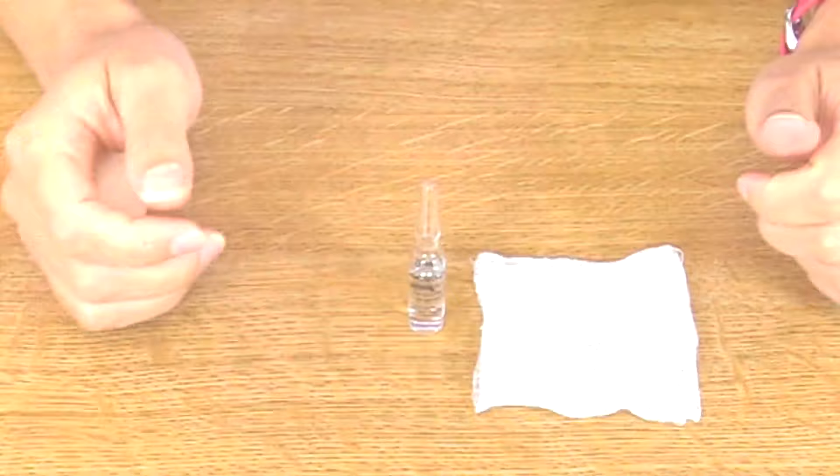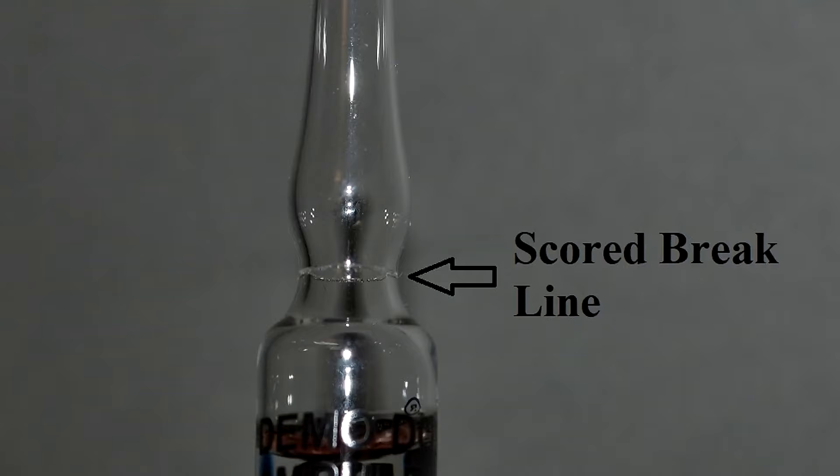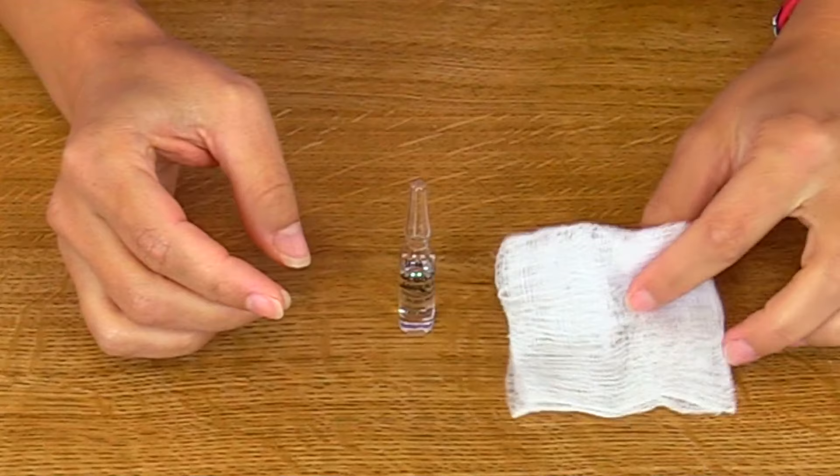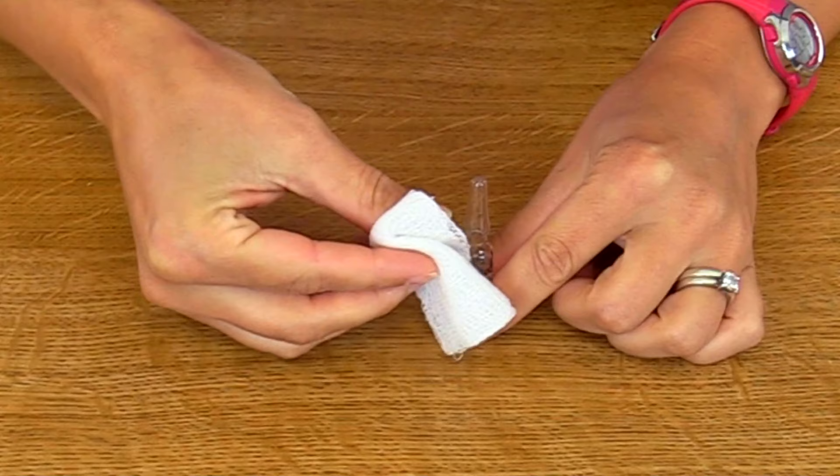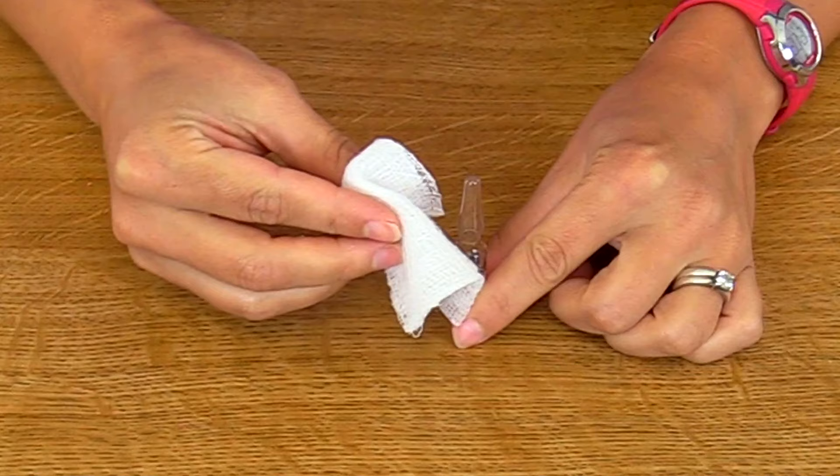Now we're ready to break open the ampule. Many glass ampules have a scored area that makes breaking the ampule a lot easier — if you have that, that's great. Take your clean gauze and wrap it around the head and the neck of the ampule. Whenever we go to break it, we're going to break it in a snapping motion, so the broken parts go away from our body so we don't get cut.